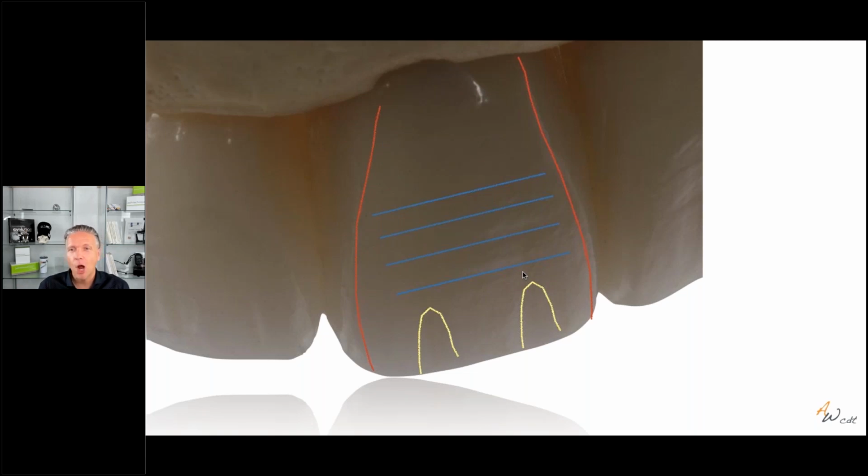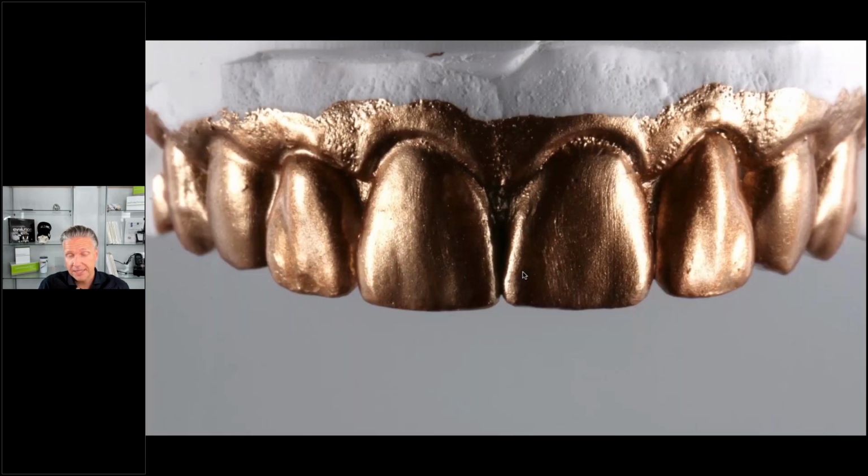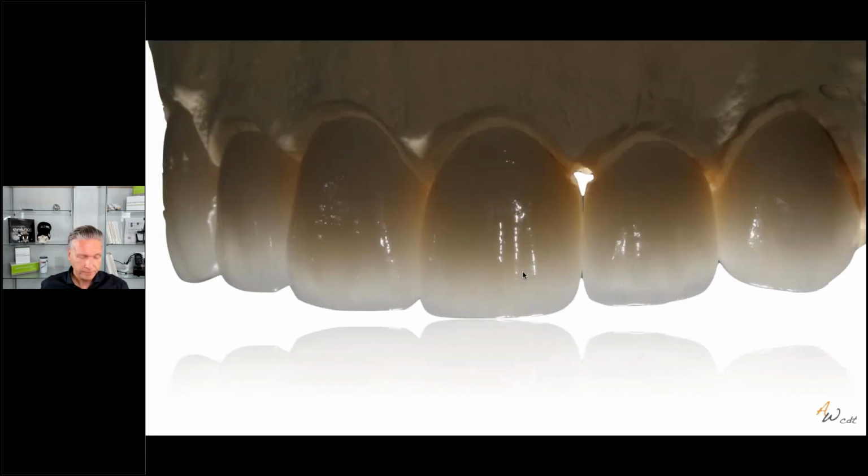Why? Because I always say less is more, and it doesn't make any sense to make a beautiful tooth with a lot of texture, like of a 17-year-old or 16-year-old teenager. It looks just gorgeous, and next to it, it's just a completely flat, natural, old 55-year-old tooth. Doesn't make any sense. So we have to always match that surface texture to the adjacent teeth. The other thing is light, right? Or sorry, a couple slides of this here, texture again.